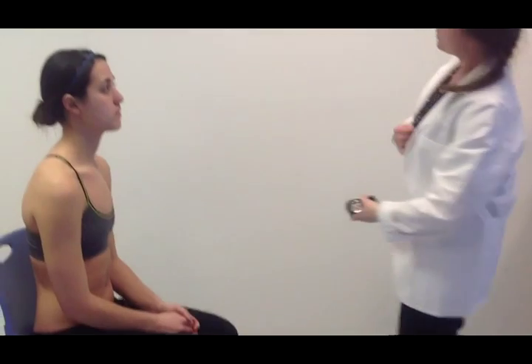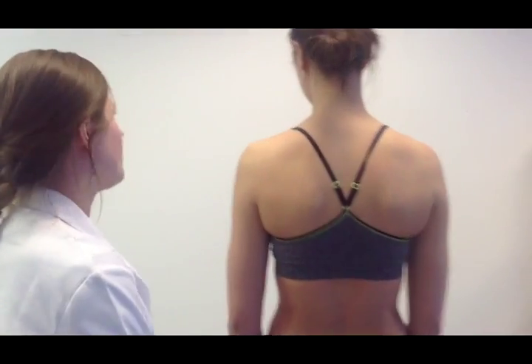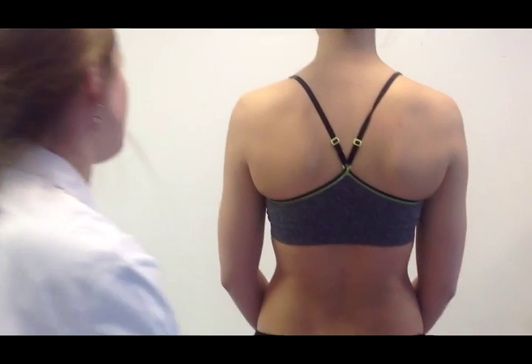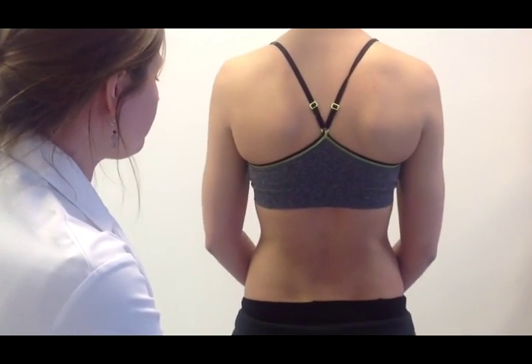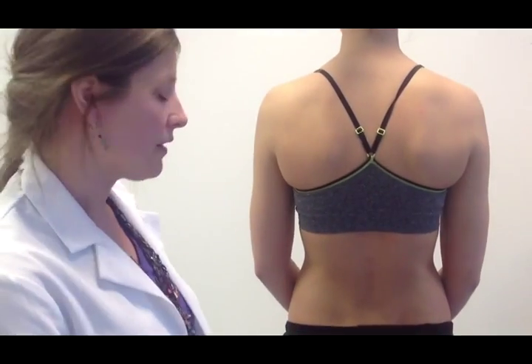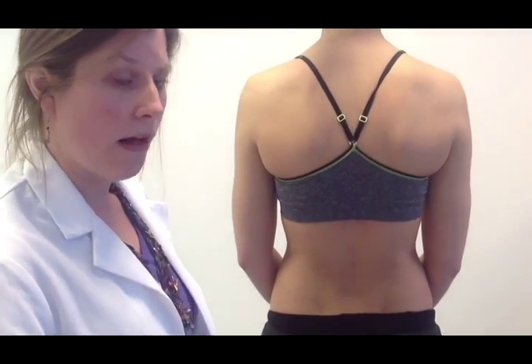Go ahead and stand up and face the wall. I'm expecting to find about five degrees range of motion, but that may be different for you — so we'll go ahead and take a look. The two landmarks you want to use for the inclinometers are S1 and T12.